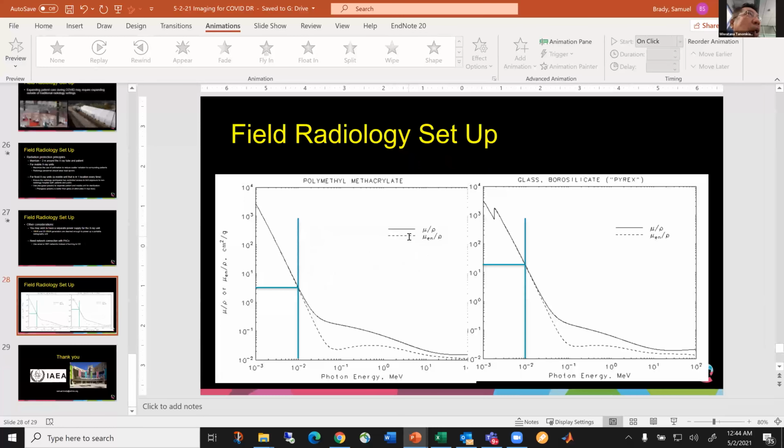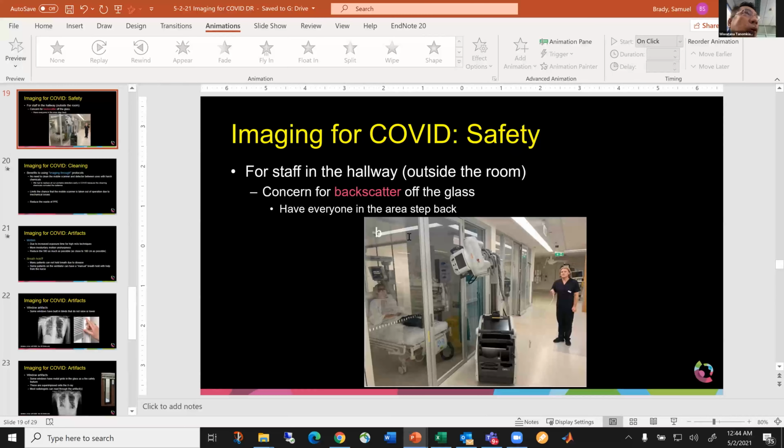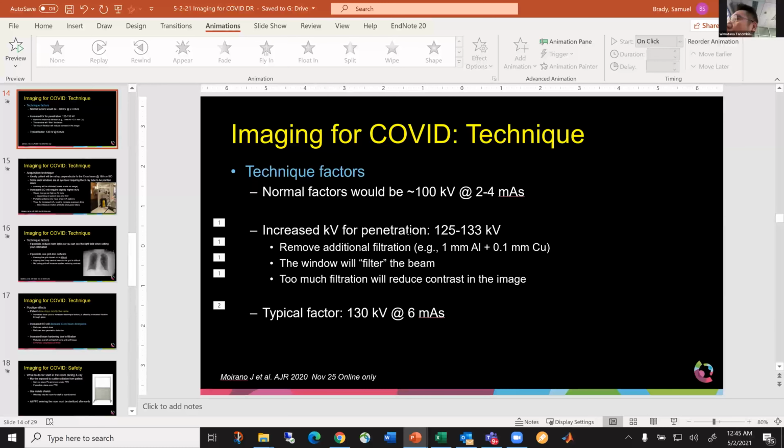So we need to select the patients, which ones for the real hospitals, which ones for the field hospital. For the field hospital, usually the patients are asymptomatic and we use chest X-ray to manage. We don't use X-ray for detection or for diagnosis, but to manage the patients. So the patients who are asymptomatic and have a negative chest X-ray will be referred to the field hospital, something like that.